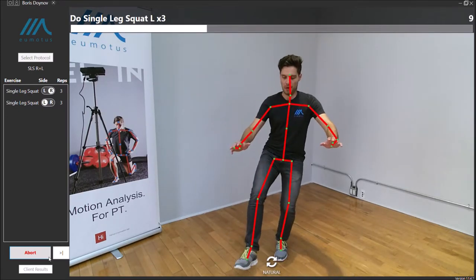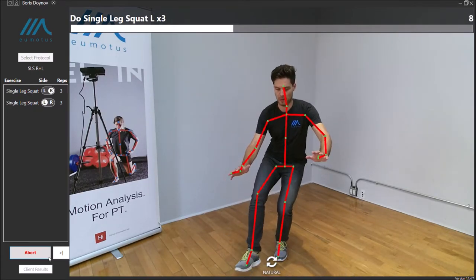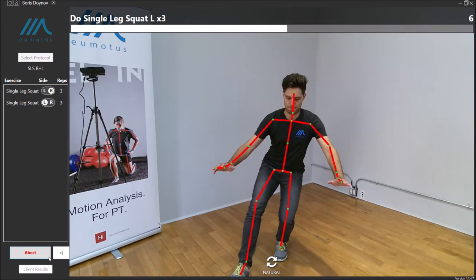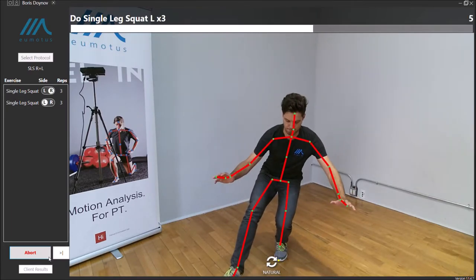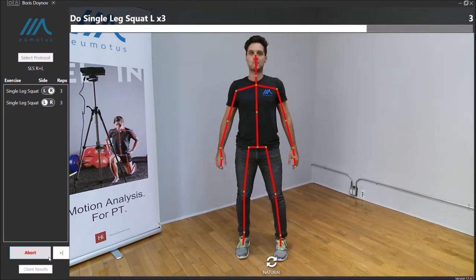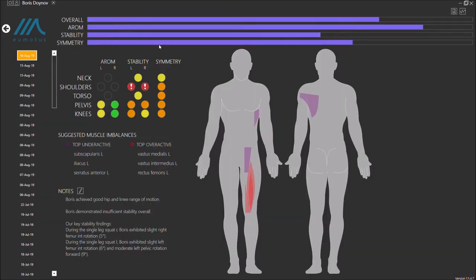As you can see, the moment our system finishes capturing Boris's movements, the Umotis dashboard appears with in-depth data about key biomechanical metrics.